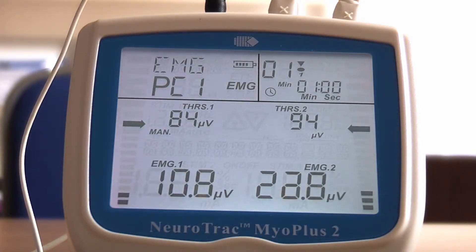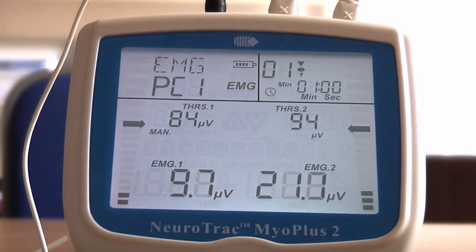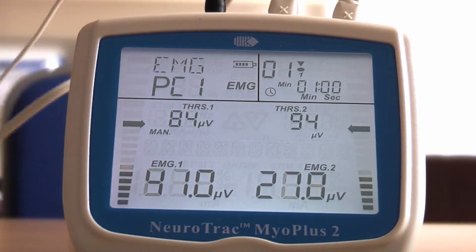Even if the impulse is so tiny the muscle doesn't contract, the unit will pick up the motor neuron spikes and this will be the first sign of improvement. On a healthy person, when their muscles are contracted, the bar graph should shoot up and display on the screen the exact level of contraction. However, on a stroke sufferer, the reading will be weak or almost non-existent. This is the EMG phase of ETS. Your physician will set you a target to achieve by your voluntary contraction, but in the majority of cases it's almost as though the muscles have forgotten how to work.